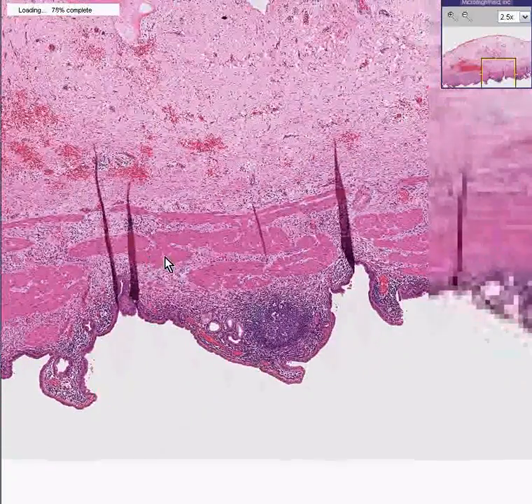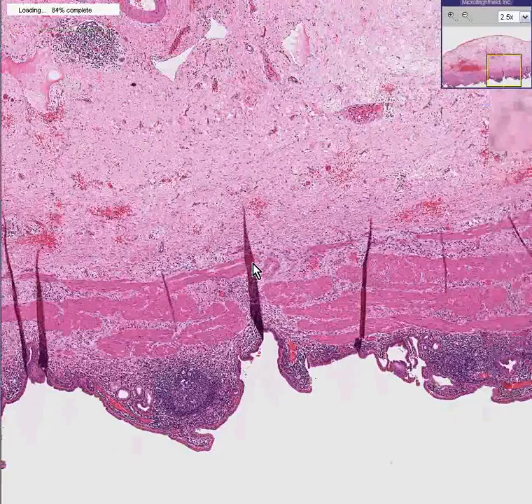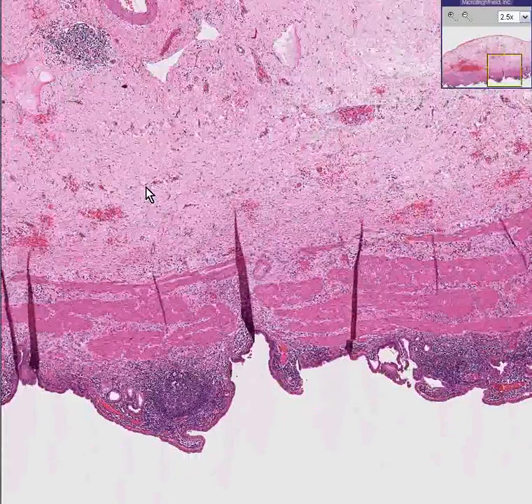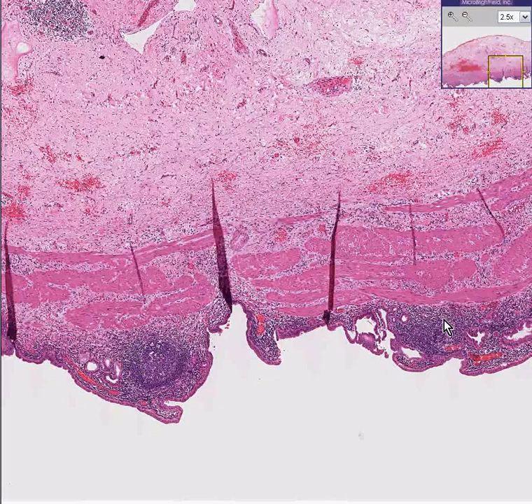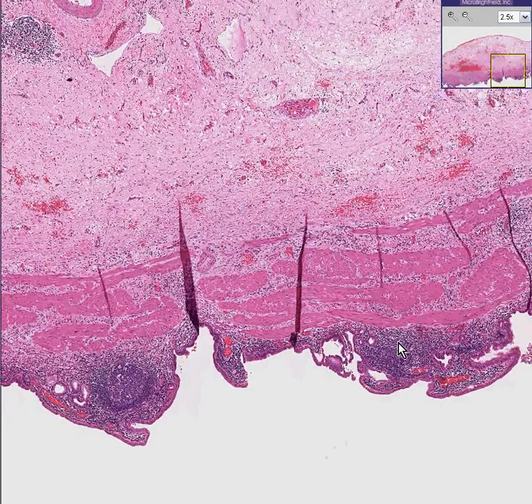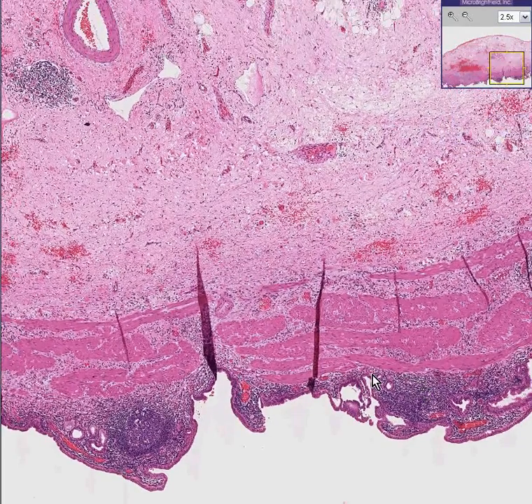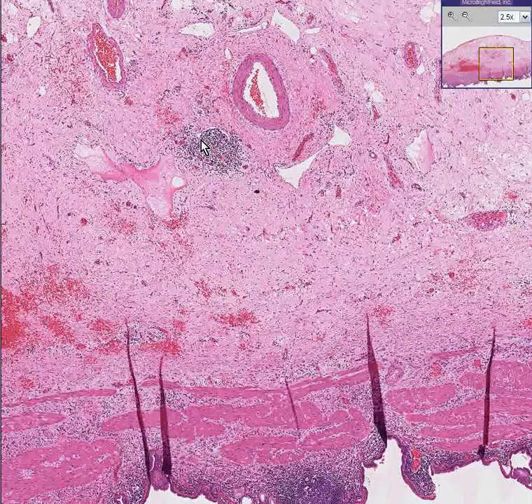If you had thrown in neutrophils rather than lymphocytes, you got another diagnosis of acute cholecystitis. Notice these chronic inflammatory cells are most dense throughout the mucosa. In some areas, they form secondary lymphoid nodules. In some areas, they are diffuse. And this area looks kind of like a primary nodule because I don't see a germinal center.